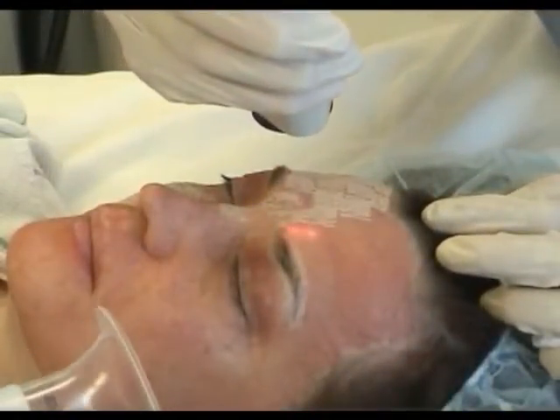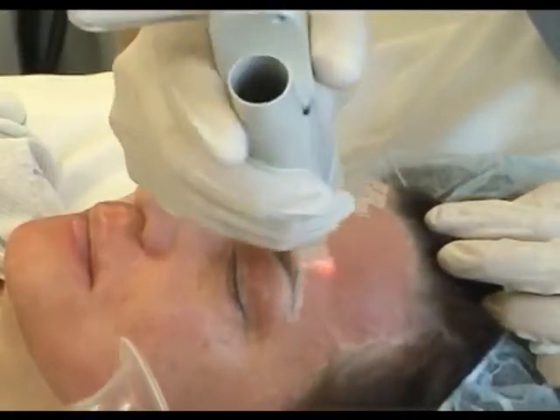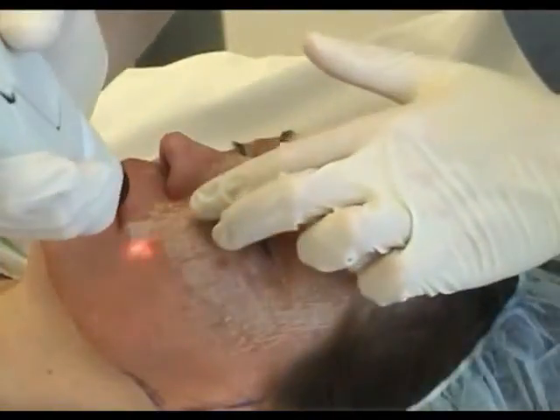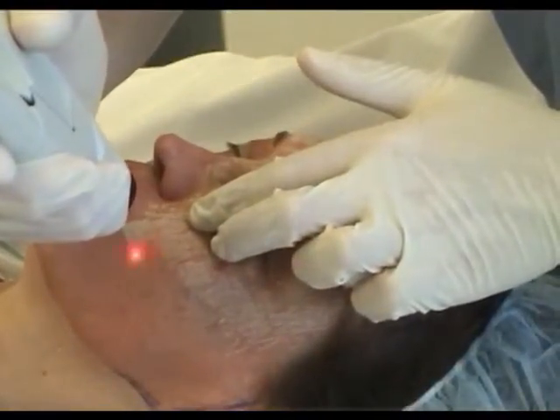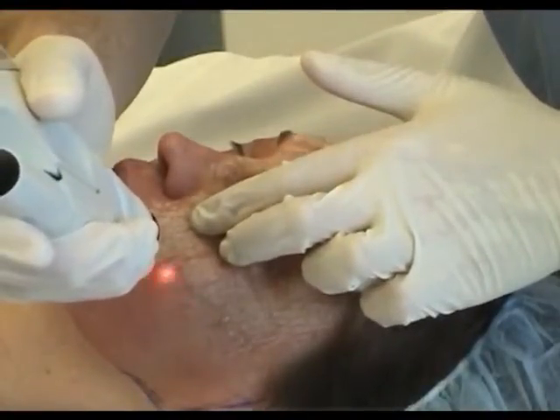This is then followed by a pass with a CO2 laser. Here we have the ultrapulse laser with a pattern generator on it at 300 millijoules and a density of 5. It is critical not to overlap passes when using a carbon dioxide laser.